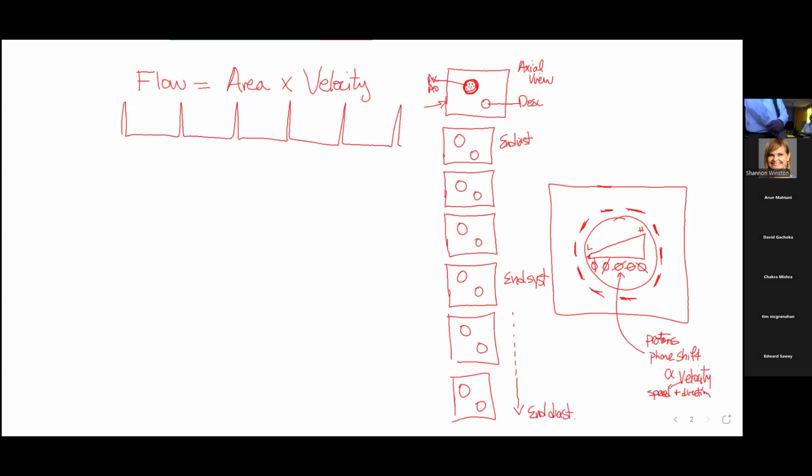So we learned before that to make this picture, we had a phase encode. Remember that? First of all, we got to be able to trigger. Let's put our triggers up here. Not going to worry about the triggering stuff just yet. So we've got nice triggers, nice QRS complex. We're going to have a phase encode.